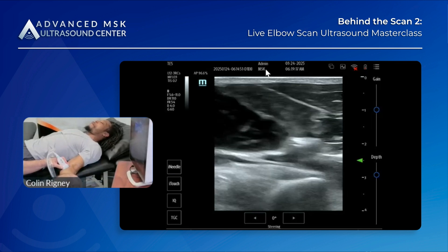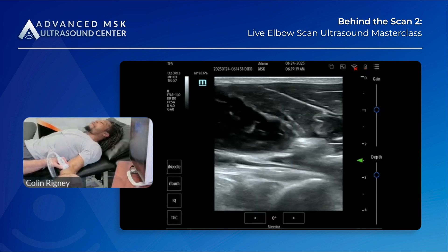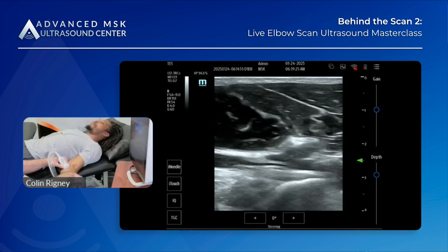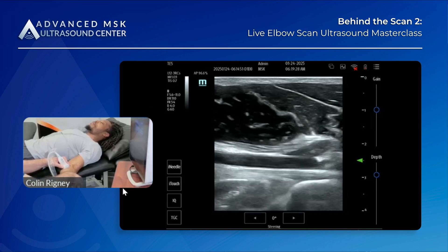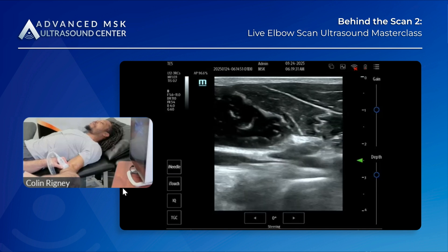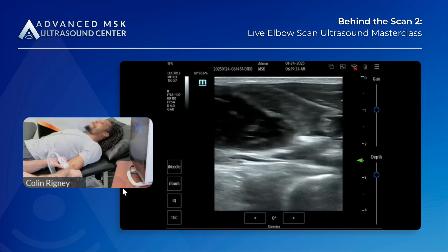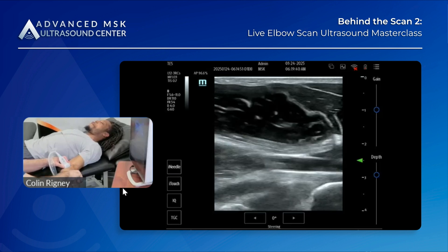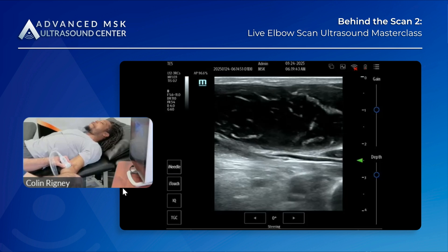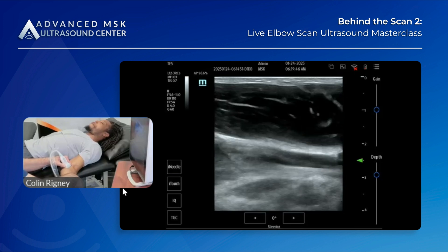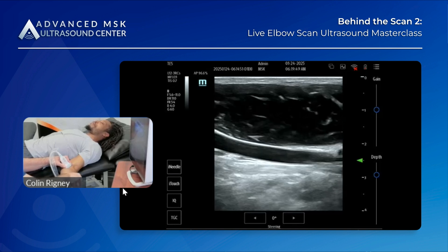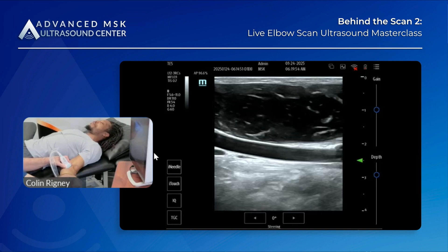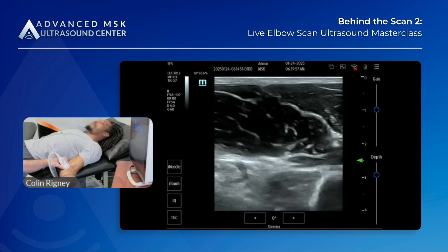The movements I'm making are just itty-bitty movements — you're not cranking them into super high range because you won't be able to track the movements as well. Just take these little baby movements. I'm pronating and supinating the forearm and you see that tendon gliding nice and crisp. The brachial artery is my guide here — right underneath it you see those tendon fibers gliding, and I can track it right to the radial tuberosity.